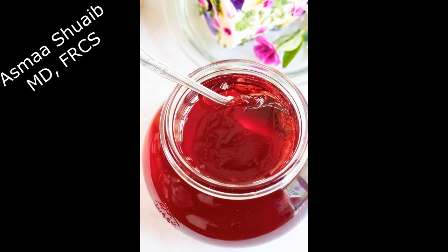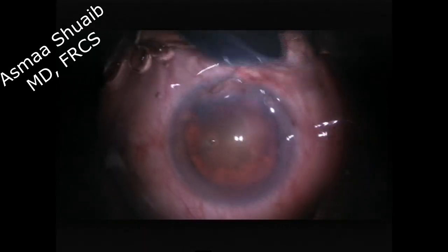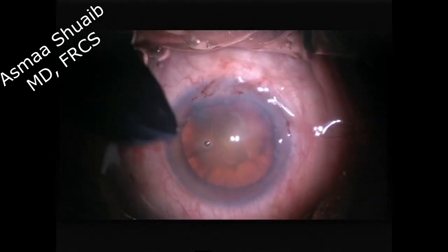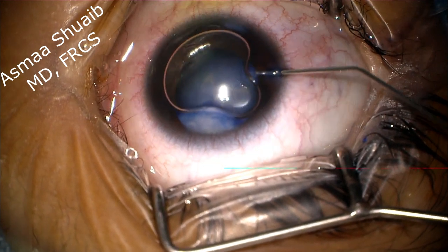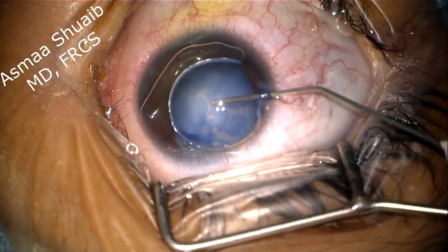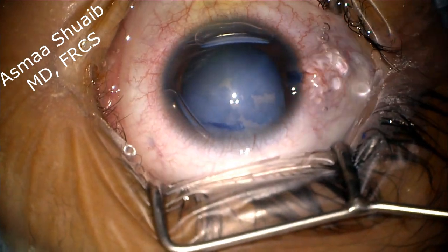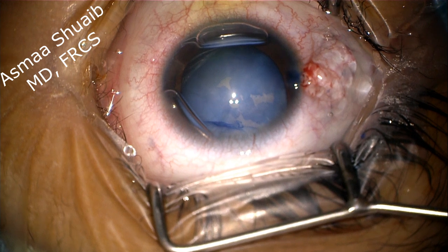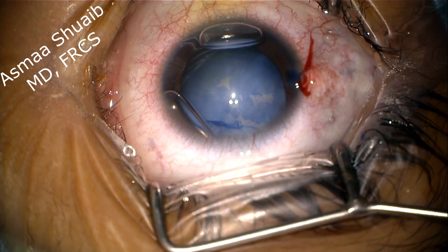And now moving to the viscocohesive material, let's start talking about Jello. You can see the consistency of the viscocohesive material when it is injected outside the eye. And here you can see the consistency of this material when it is injected inside the eye. Just notice the material that is getting out of the MVR incision, which is looking like Jello.